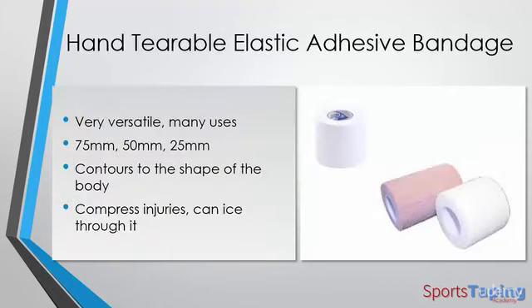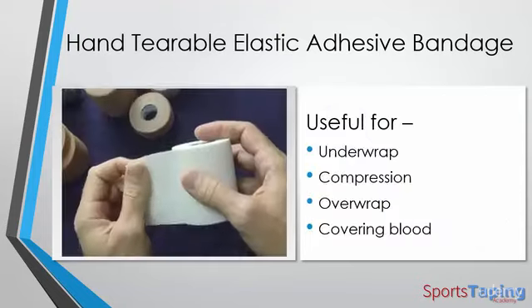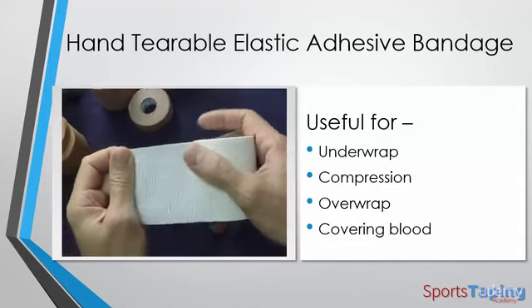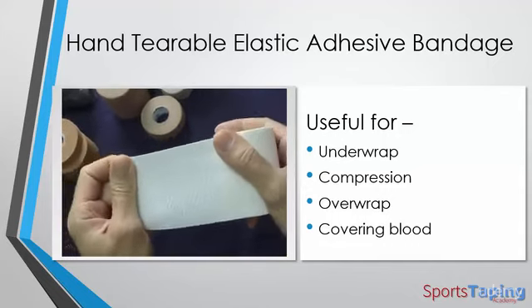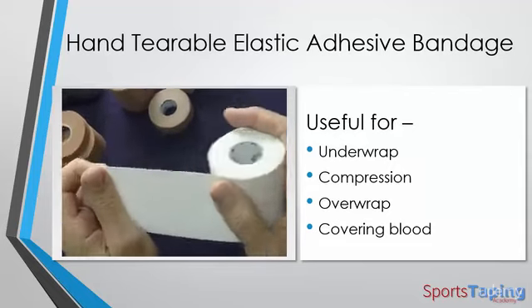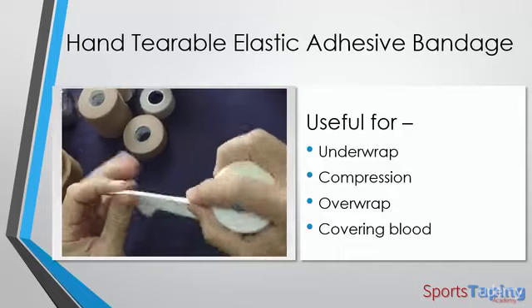Okay, let's have a look at hand tearable stretch. Now, I really love hand tearable stretch. It's probably one of the most versatile tapes in my kit. It's because it's very, very light. It's got a lot of stretch there, so you do have to be careful when you're wrapping around a limb so that you don't cut off circulation, but it's got a lot of stretch, and it's very, very fine.